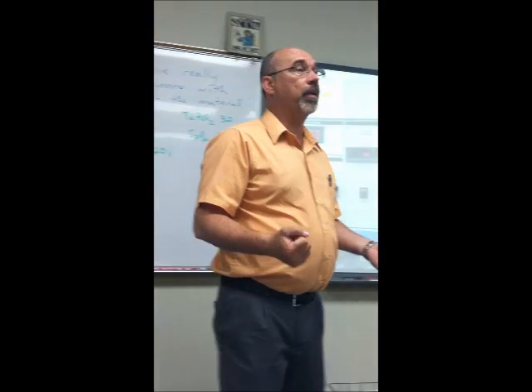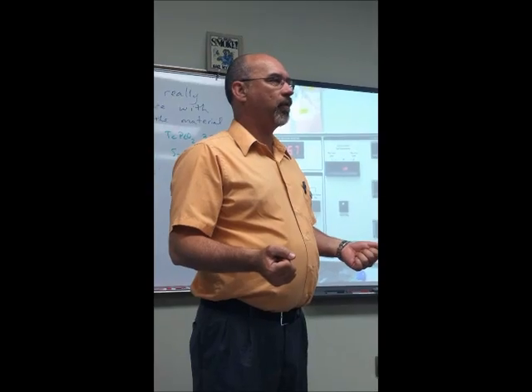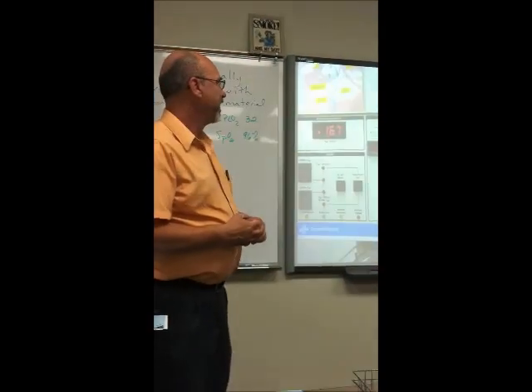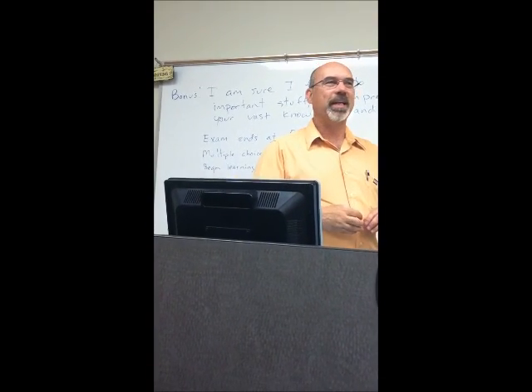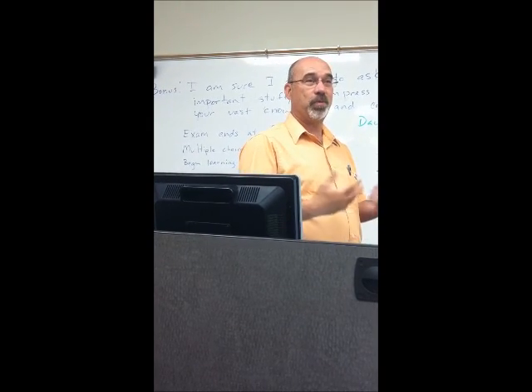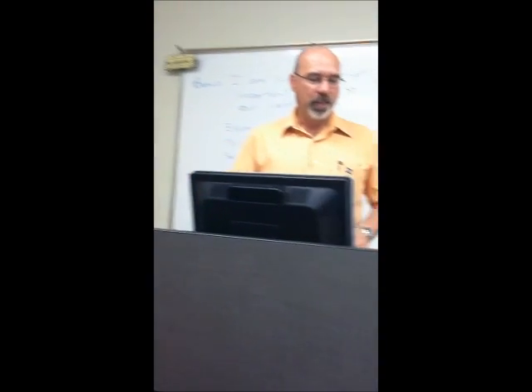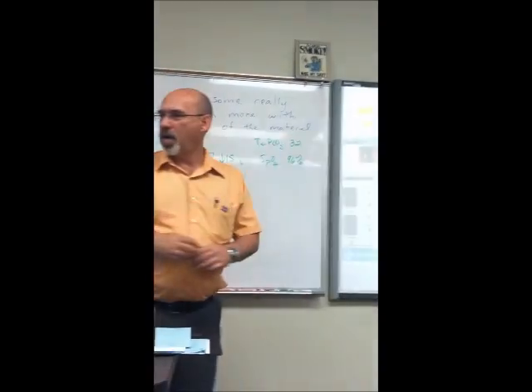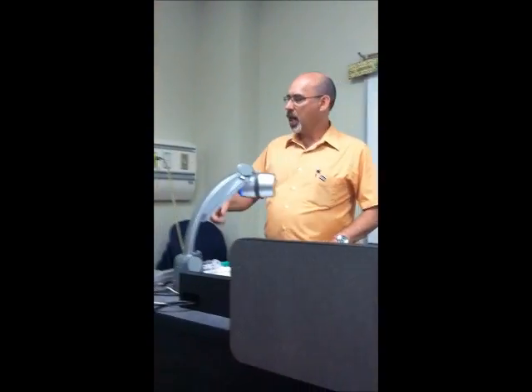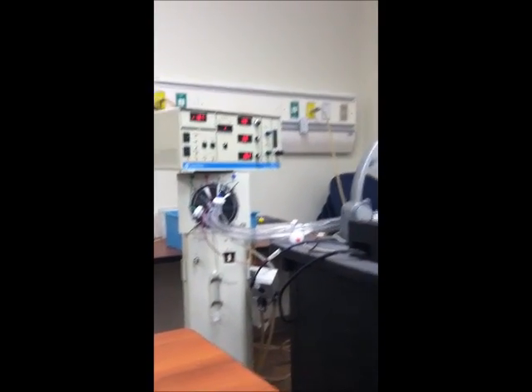When I was at Methodist, Randy gave us a circuit because somebody had opened one up and they ended up not using it. So that was really a nice gift. I'm not insinuating that you guys should try to open stuff up so we can have it out here. Don't do that. But whenever I can get something that expensive, just accidentally, it's kind of nice. Because the old circuit needed to be changed out. You can imagine the wear and tear on the diaphragm here. You may not appreciate it unless you're sitting where Cameron and Chelsea are, but it's going to give out.